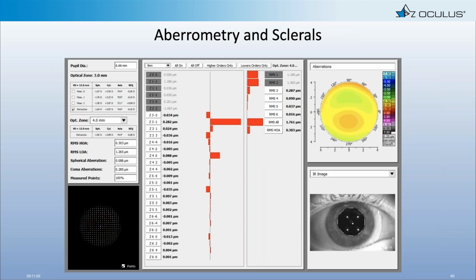One thing I want to mention last and not least is as scleral lenses, as we're moving into more and more custom options, not just with our fits, but also visually speaking, correcting for things like higher order aberrations and understanding higher order aberrations in our irregular cornea patients in scleral lenses becoming more important, something which is more on our radar.